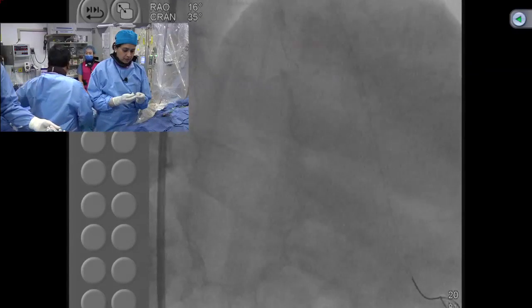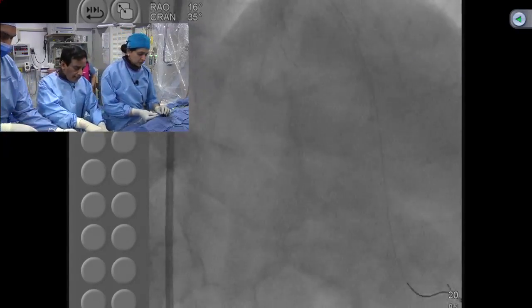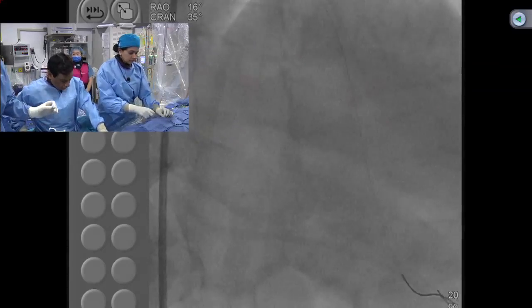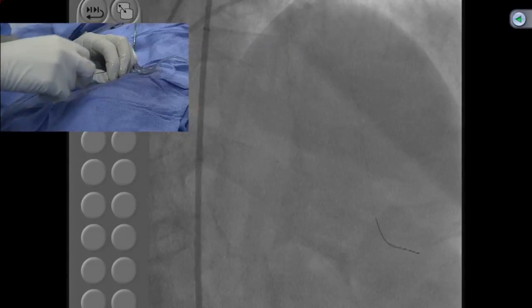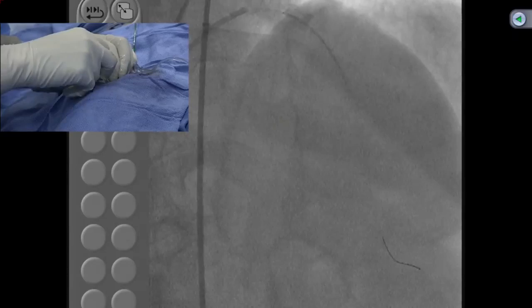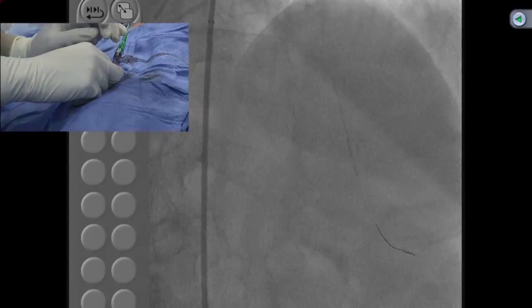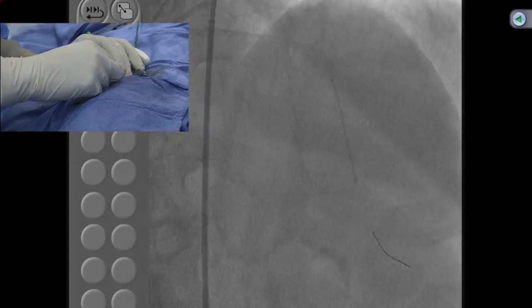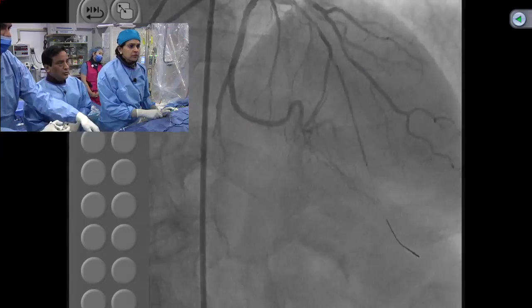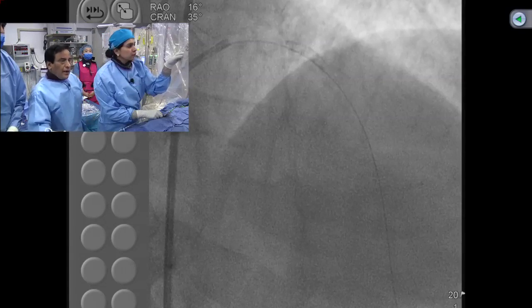But that's a very important point actually. As you saw this month in JACC Intervention, I have the review article, the state of the art paper, the current status of rotational atherectomy. We go through it and make our algorithm for use in the calcific lesion, whether rotational atherectomy or orbital atherectomy. But more importantly, which lesion is suitable for one versus the other, and what are the comparative data. We are actually looking at it now. We have done 100 plus cases of orbital atherectomy in the last 5-6 months with a 30-day follow-up, and compared over the same time with rotational atherectomy to see which lesions.